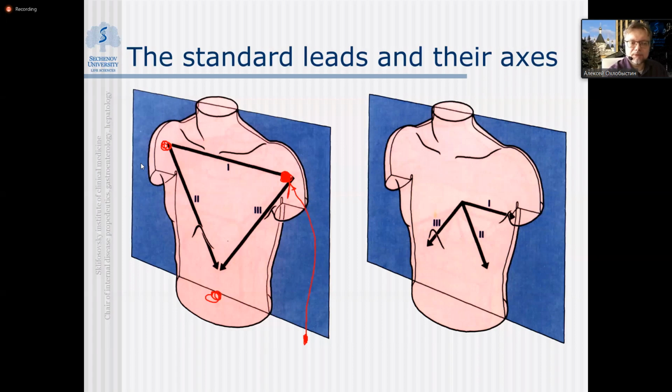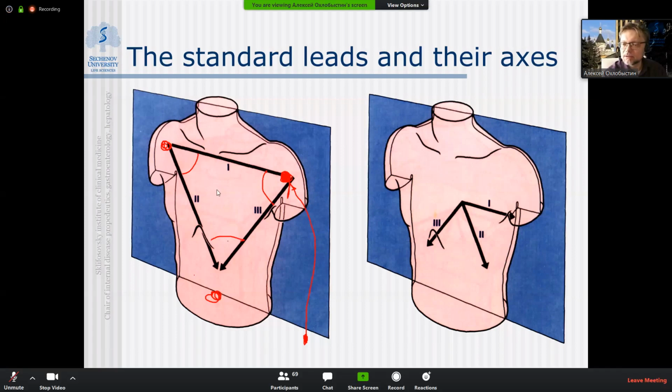So from that point of view, we have a more or less equilateral triangle. And in the case of equal angles, all angles will be more or less which amount? Jabal, Otman Hamid, yes, 60. 60, yes. All angles should be approximately 60 degrees. Good.